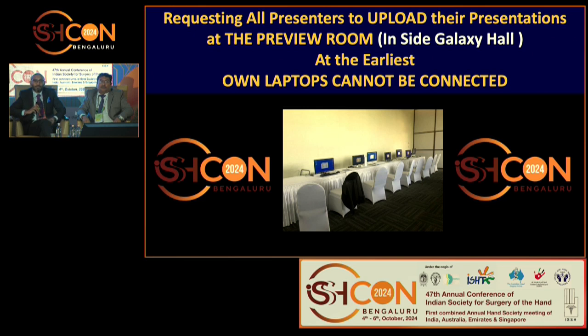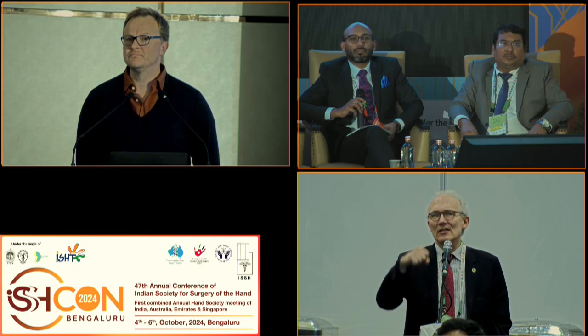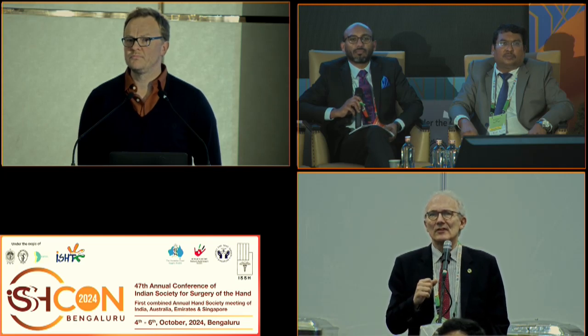Sometimes we get patients with quite severe STT arthritis where there's so much scaphoid erosion that the scaphoid is now vertical, and they have a DISI collapse of the lunate. Can you correct that angulation arthroscopically, or would you then prefer to go open?